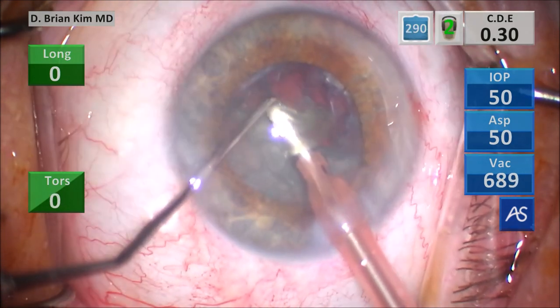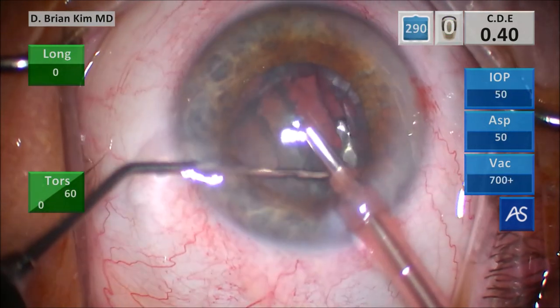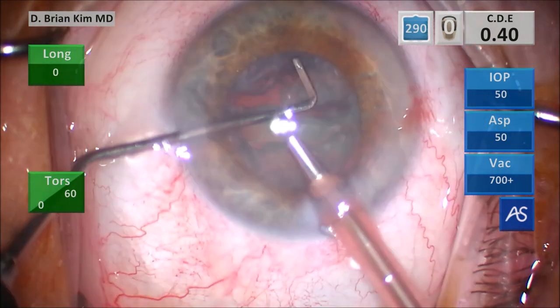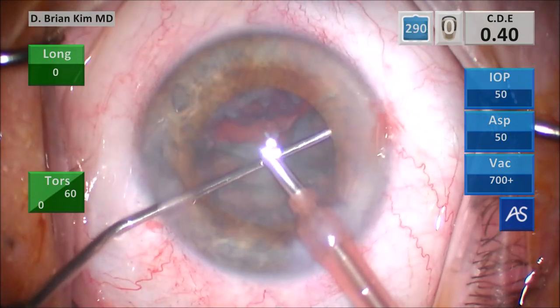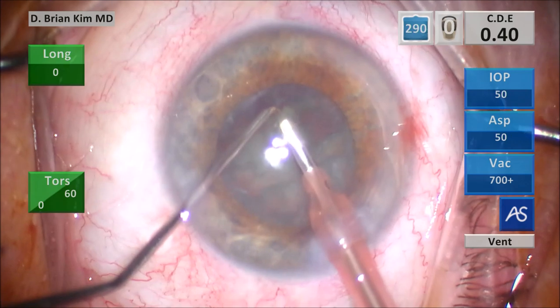Crushing it with the instruments and emulsifying the lens pieces. Grabbing, trying to turn the lens so I can get to that one fragment there. That's the remaining part of that second quadrant — lift it up with some vacuum and then emulsify the lens pieces.